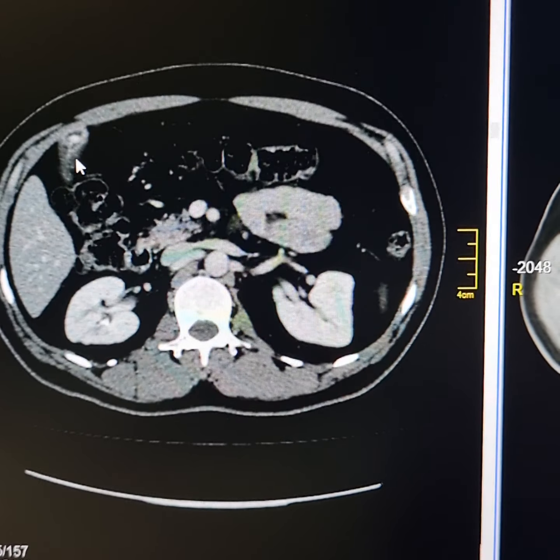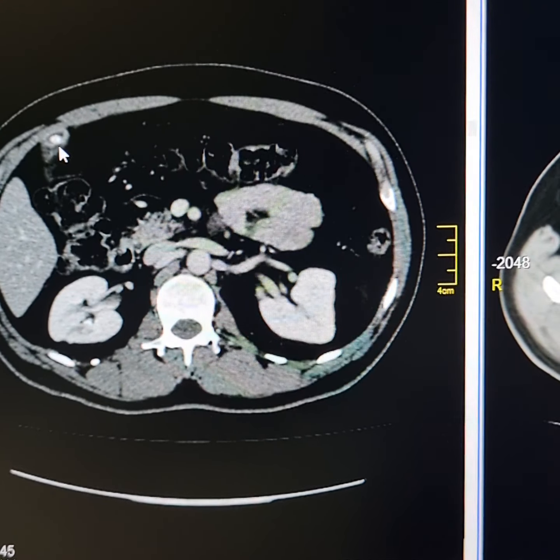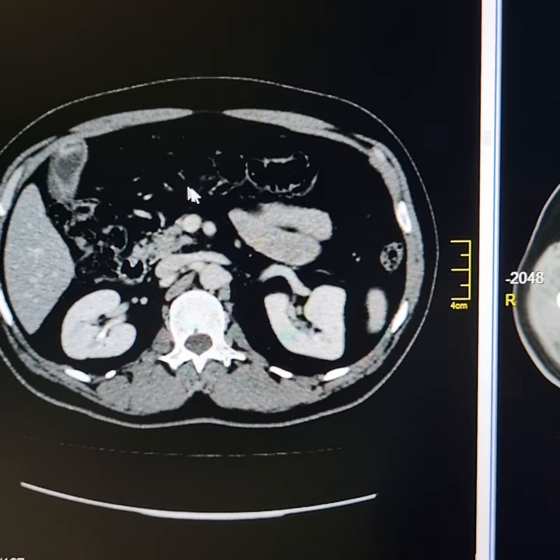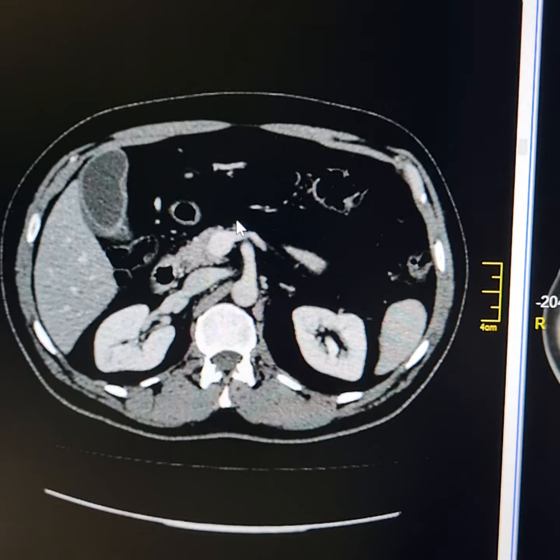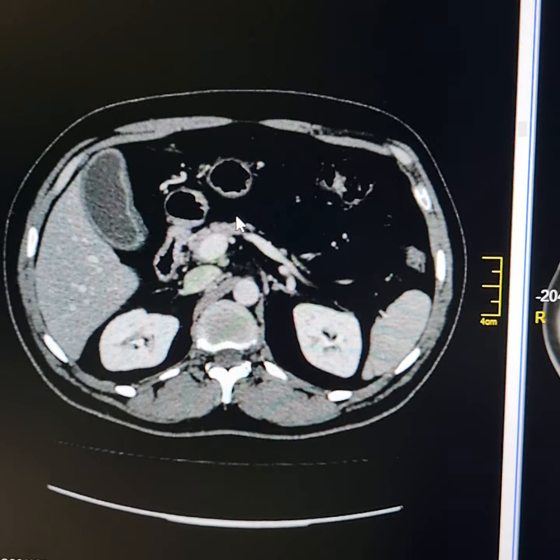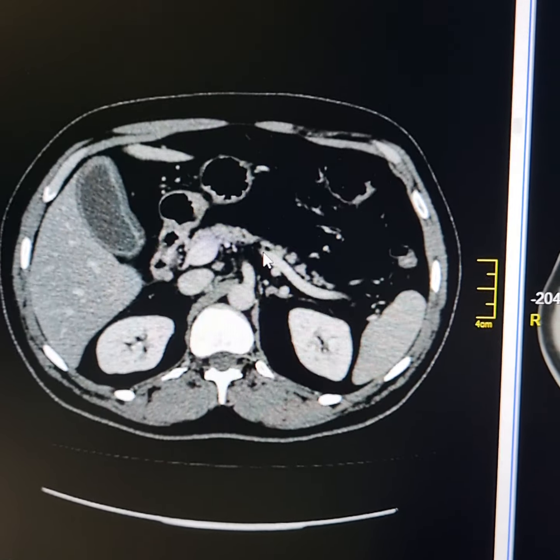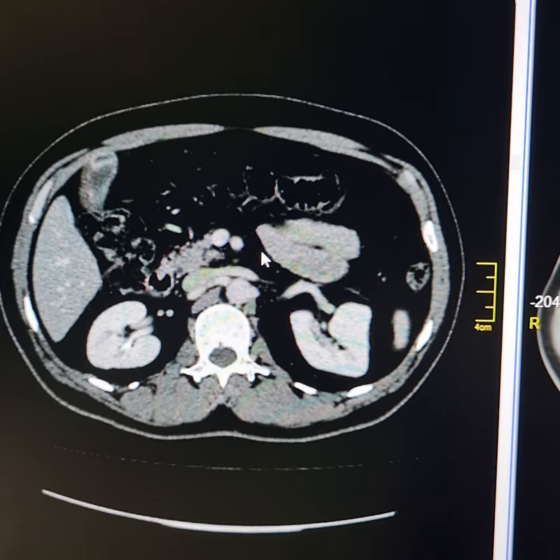Now this is the Phrygian cap deformity here. It is a very small Phrygian cap and there is a calculus here. While doing ultrasound, there is always a likelihood that we miss such calculi which are lying in the Phrygian caps, and especially if the Phrygian cap is this small. Patients may have acute focal cholecystitis in the region of the Phrygian cap.